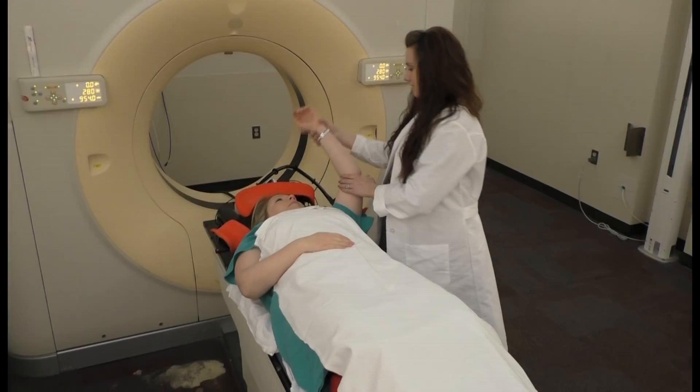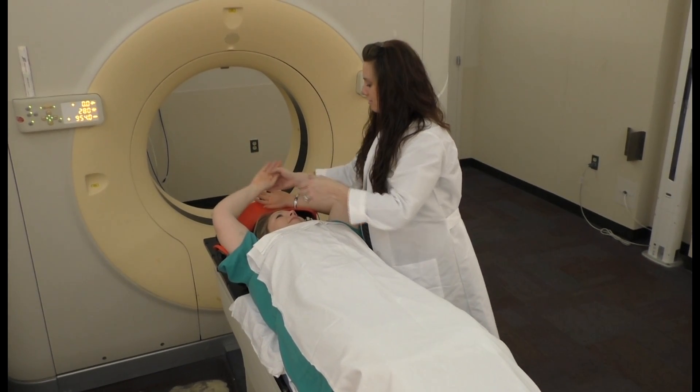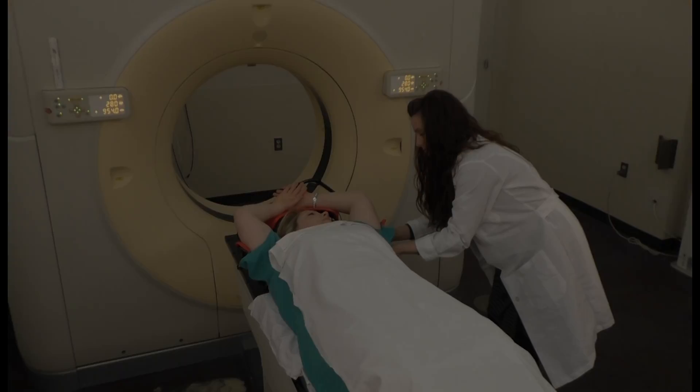When you enter the simulation room shown here, your therapist will help you onto the table and arrange your arms comfortably over your head. The process in the treatment room is often quite similar.